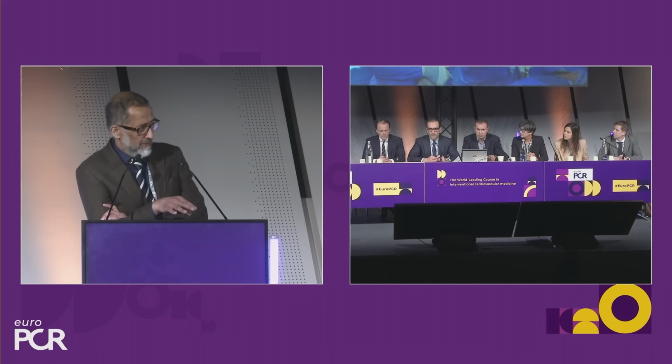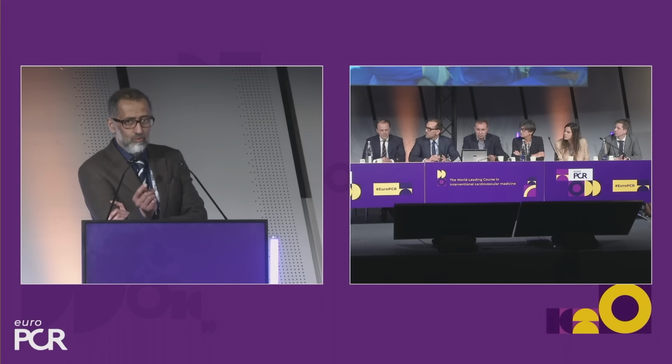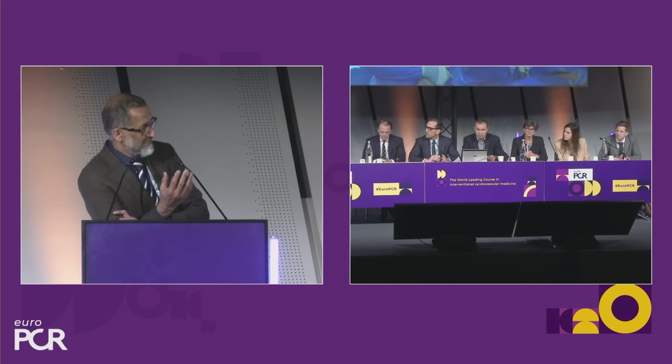Okay, fantastic. So to summarize what we were trying to achieve: not too low a height because that would increase pacing, not too high a height because that might lead to a valve pop-up and actually make coronary access more difficult, which we'll come to at the last part of this presentation. And then when we're deploying the valve, we're looking at the height, but we're also looking at the crowns that are all along the bottom of the frame. And if we can see all of them are evenly spaced around the annulus, then there's very little chance of extra tension suddenly arriving and the valve popping upwards later.